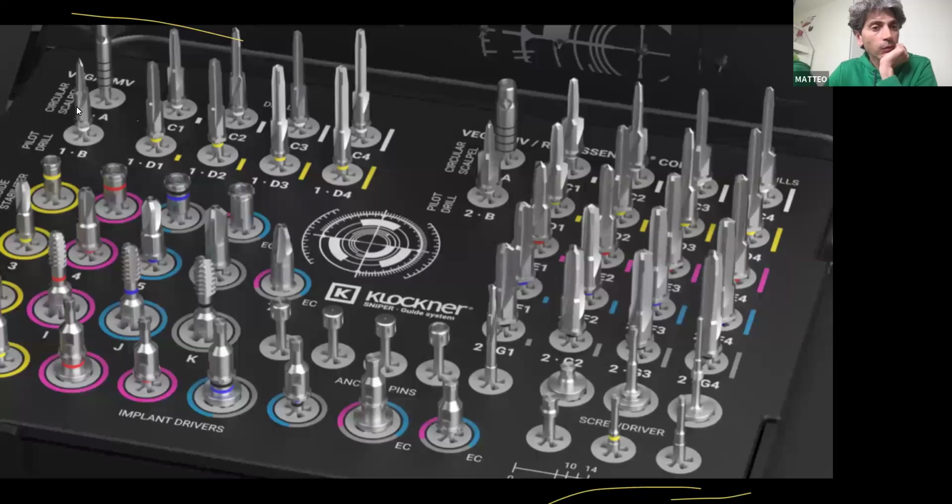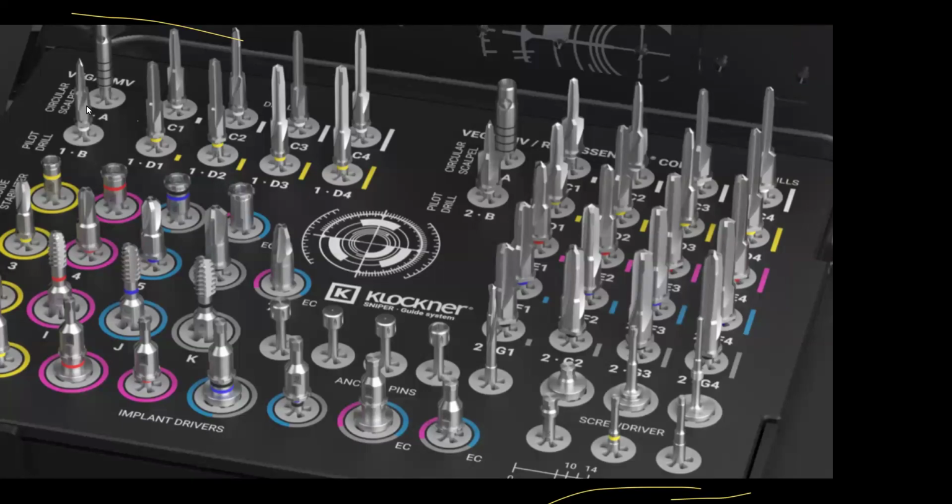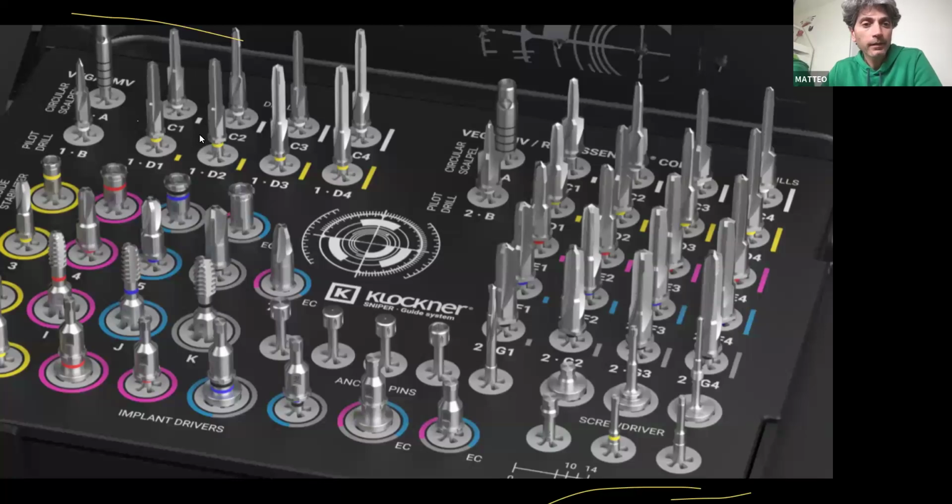For the 3.0, 3.1 micro VEGA implant, you use this pilot drill. Marked with code 1B, it is the pilot drill for narrow implants of 3.0 or 3.1 diameter, so it is different.